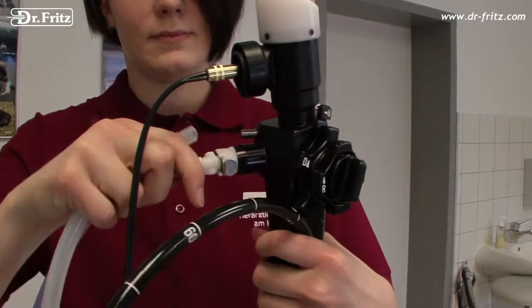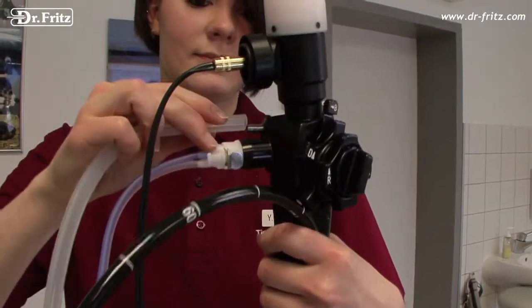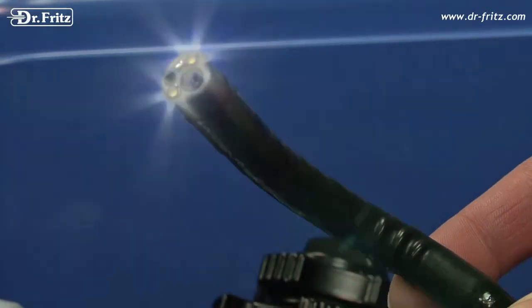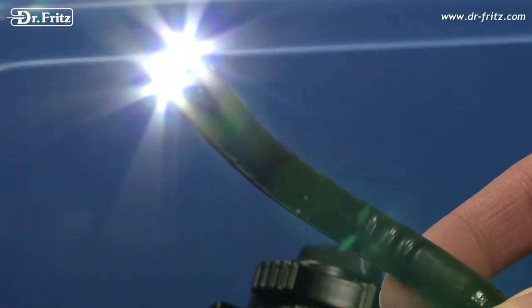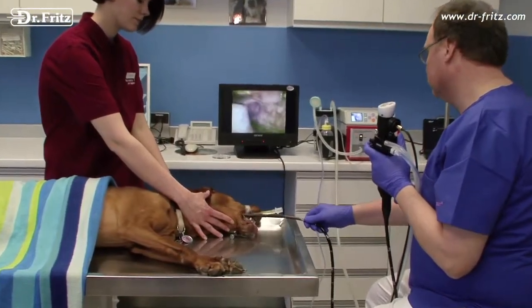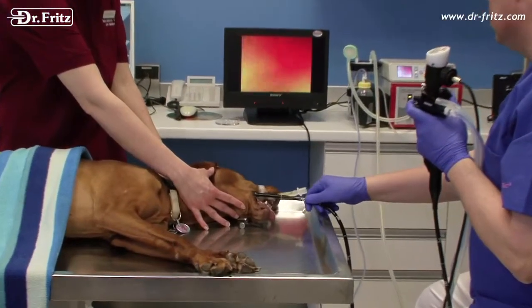A double tube guarantees air and water supply. The suction tube is connected to a vacuum pump. There is no external light source needed due to the integrated LEDs in the tip of the endoscope. The video chip and video processing unit is integrated as well.